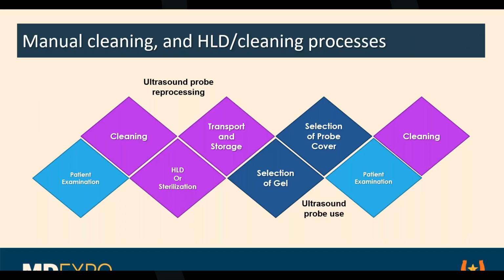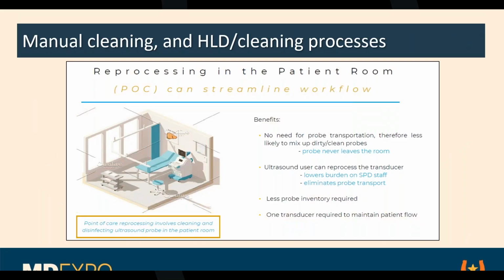But store these things so they don't get smashed up or broken while they're just hanging around, air drying, and with good high level protection. Here's the inside of the sonographer's room. Reprocessing in the patient room, at the point of care, can streamline the workflow.